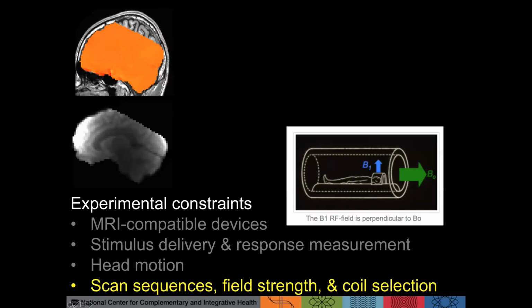And so we have to make decisions about what size slices we prescribe. So the imaging is actually a big block of slices, and we collect brain data one slice at a time. And so in this study, I will not be able to make any inference about what's happening in S1 because I don't have S1 coverage. So sometimes you have trade-offs between what brain regions you want to make sure you can recover signal in, if they're sensitive to dropout, and you lose other regions in turn.